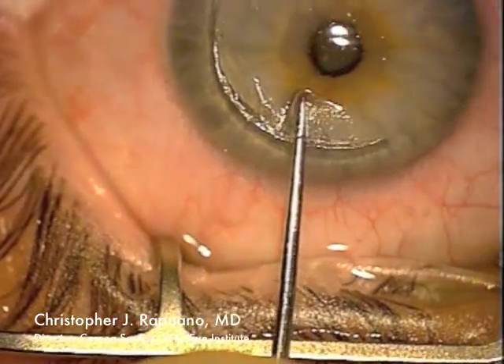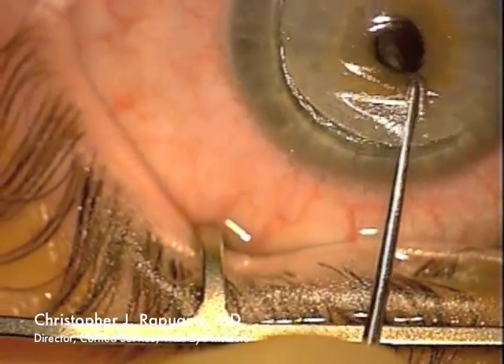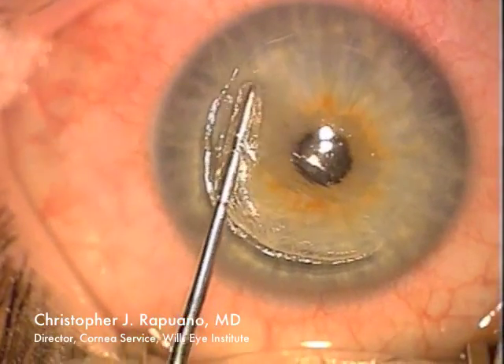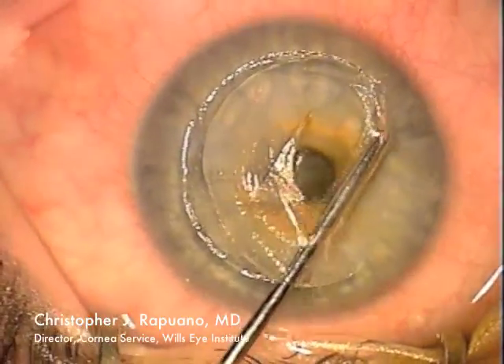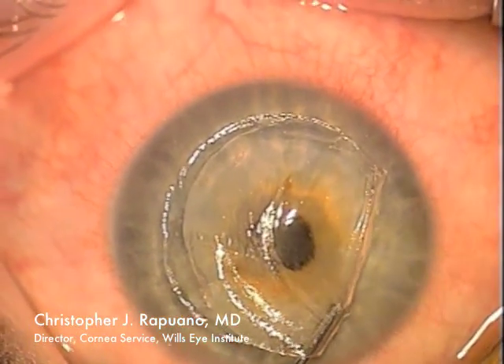I then take a spatula and lift up the flap. I am very, very careful to indent the cornea posteriorly — to press on it — so that I do not poke a hole in the flap. It's very easy if you lift up the tip of the spatula to poke a hole in the flap, which is needless to say, not desirable.